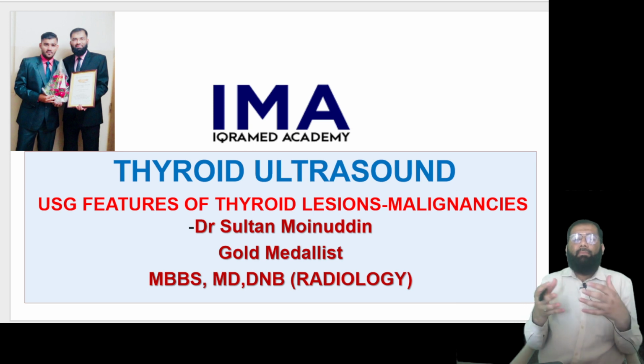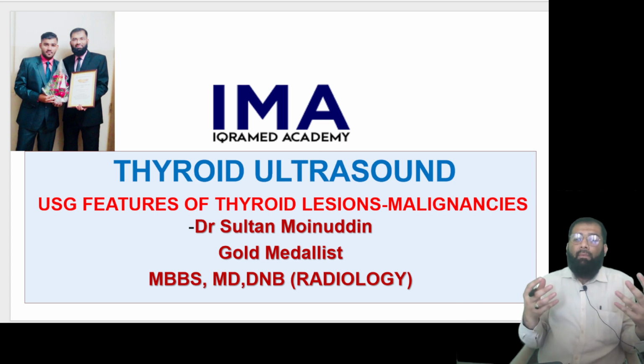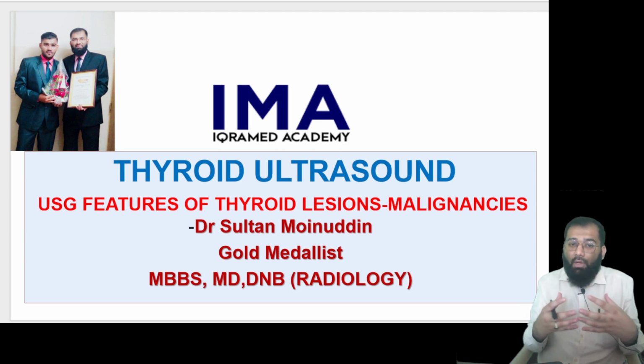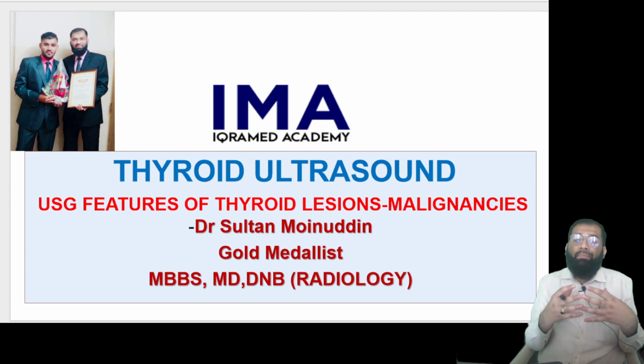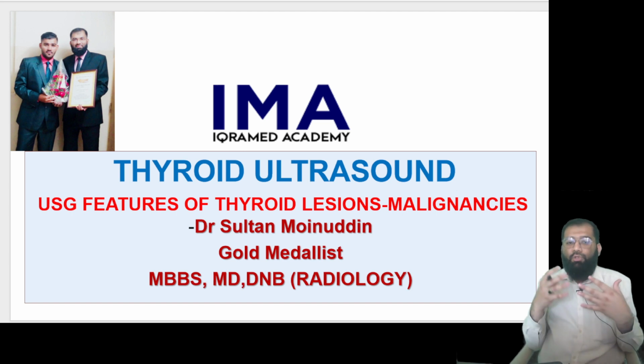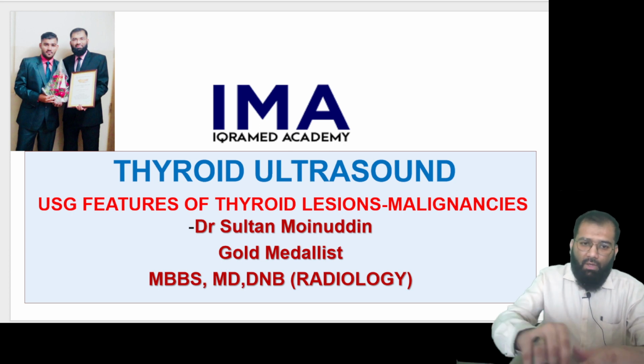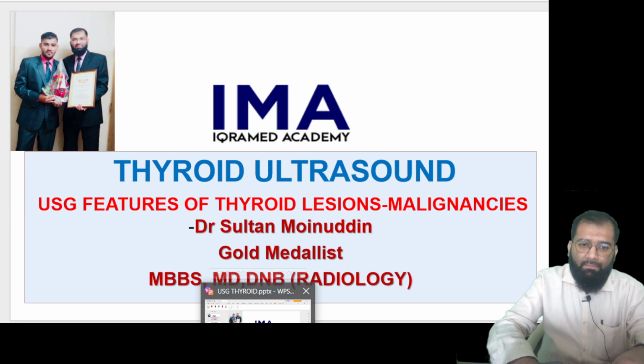At the same time, we will see many findings which are ancillary, other than the features which should be seen in those patients. So I will also advise you on the clinical importance of diagnosing follicular CA or papillary CA or medullary CA. So we'll be seeing all of those in this session. So without any delay, let us begin after this brief introduction.